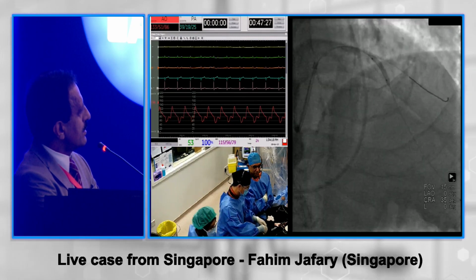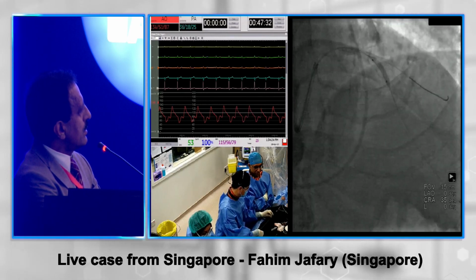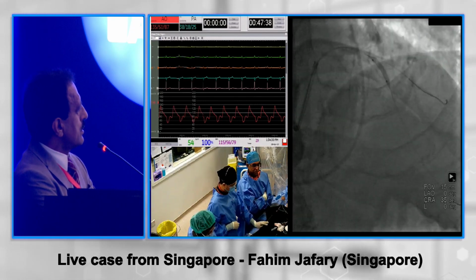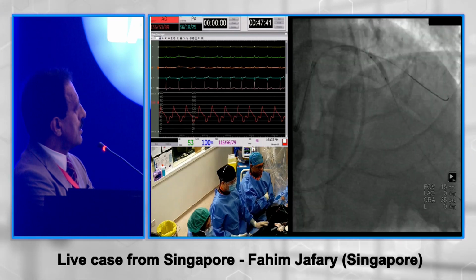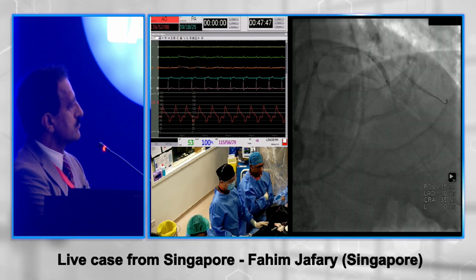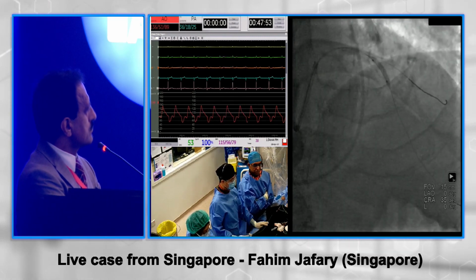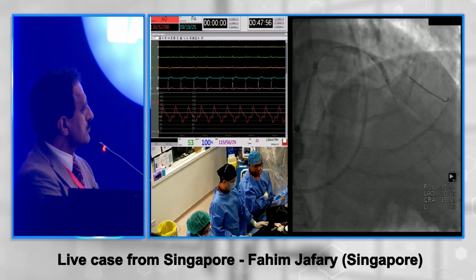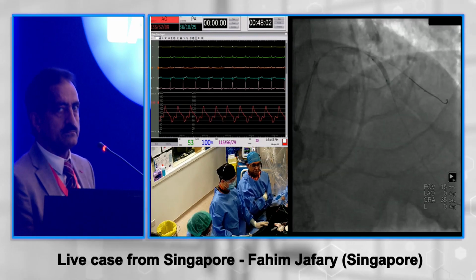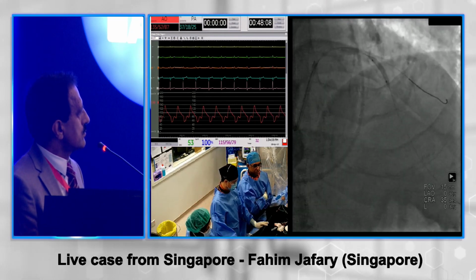My comments here are, from here on, I'd keep it simple. As long as I've got PA pressure monitoring and PA sats, which is what I do very regularly in such situations, I would then move to balloon dilatation to see whether rotational atherectomy had sufficed rather than use more tools. As long as you have a complete expansion of the balloon in 2 orthogonal projections, you've done the job, and that's my clear indication. Not so much IVUS, more OCT, but balloon expansion of an optimal size balloon in 2 orthogonal projections after calcium modification would be my tool, and I think that's what is being done right now.